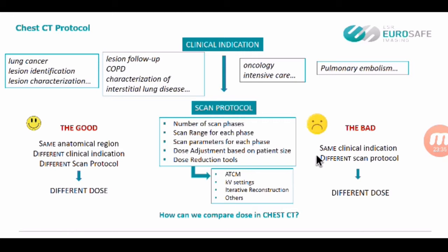Afterwards, we'll tell you something about this. And different scan protocols mean, of course, unfortunately, often it happens in the clinical routine that we have different scan protocols also for the same clinical indications. I've already found on our CT scanner protocols with a person's name or surname, like Chest Piero, Low Dose Dr. Rossi, and so on. This is not so good.